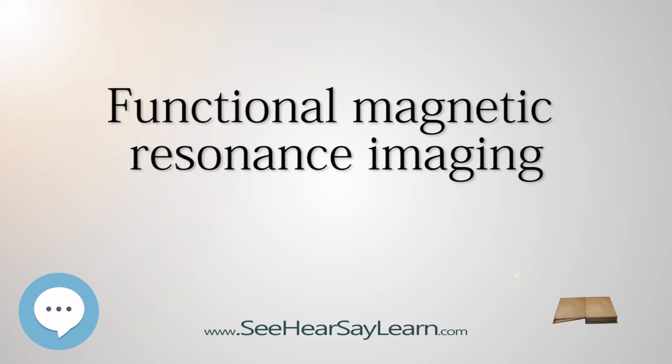Another source of physiological noise is the change in the rate of blood flow, blood volume, and use of oxygen over time. This last component contributes to 2/3 of physiological noise, which, in turn, is the main contributor to total noise.